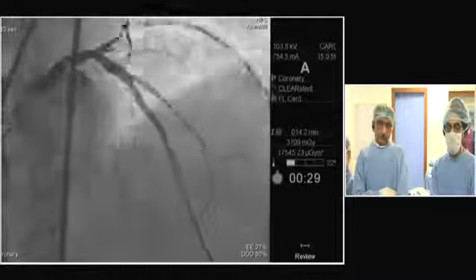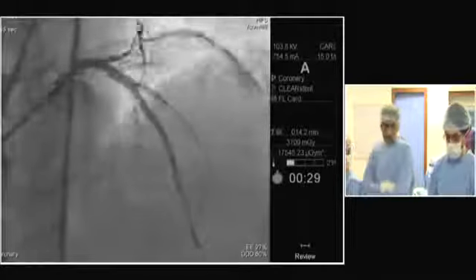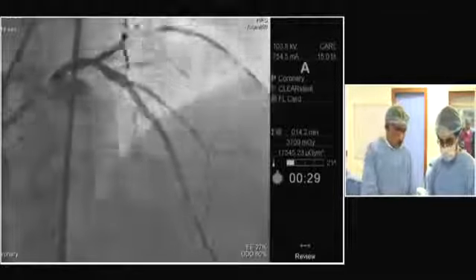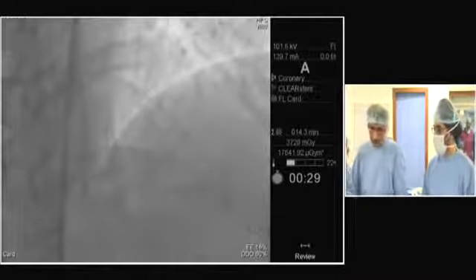Very important comment. So according to the IVUS images, the proximal stent segment is not completely expanded. So we need to use even a 4.5 non-compliant to do the POT. The 4.0 that was used was non-compliant. So you can also use a 4.0 compliant, short balloon, and you can push it up to 4.5. Okay, we are taking a 4.5 compliant balloon for the proximal segment, 4.5 by 6. So as you saw, I had taken the stent a little back to allow for a good POT to happen.